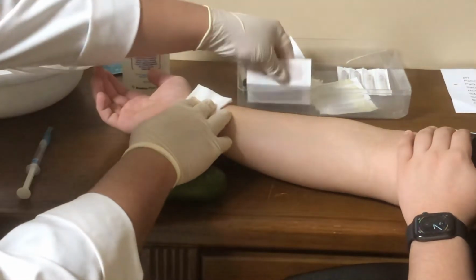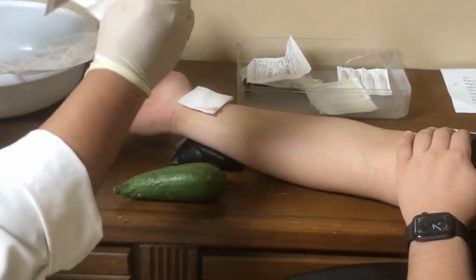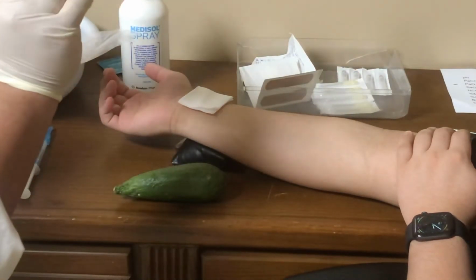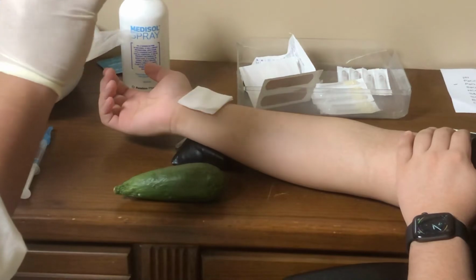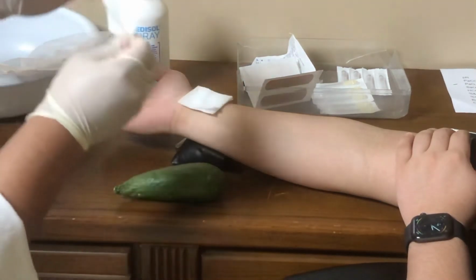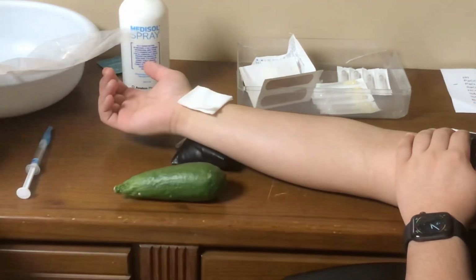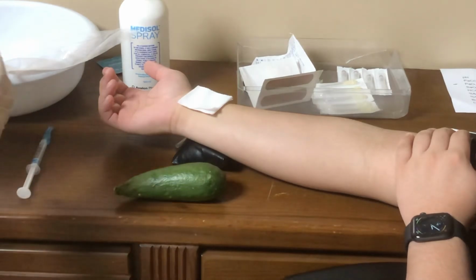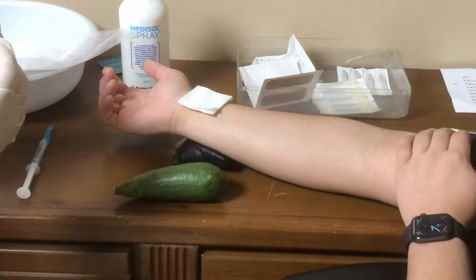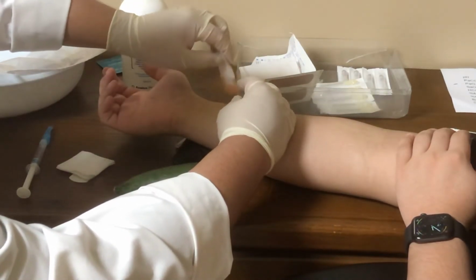After this has been successfully done and the bleeding has stopped, make sure to put a Band-Aid on the site in order to avoid any further infection to the wound. At the same time, make sure to dispose of your items in the proper disposal area in order to avoid any spread of contamination.